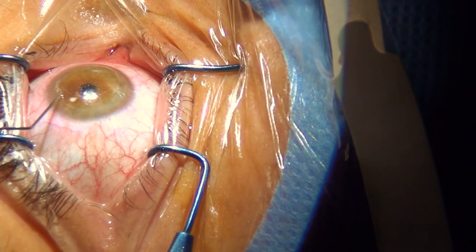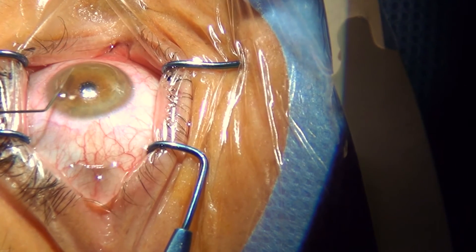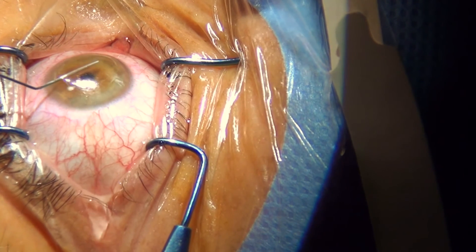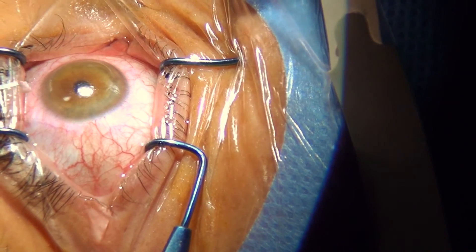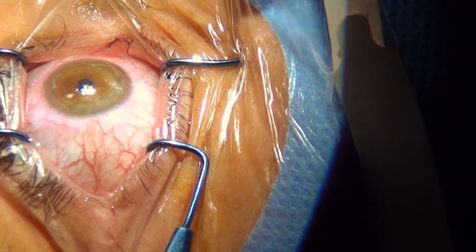Personally, I prefer to rinse the interface with BSS or Balanced Salt Solution to remove all possible debris or lint. This is something that all surgeons do. Before removing the eyelid speculum, we put in some dexamethasone 0.1% drops and some antibiotics.